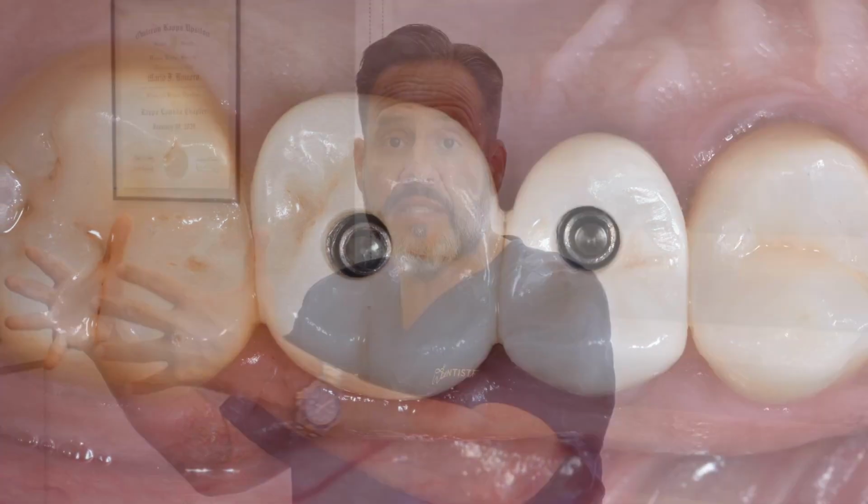That custom abutment is going to give you the support for the tissue that surrounds your implant, giving you the ideal emergence profile and making this tooth look very natural, like it literally comes out of the tissue, just like natural teeth do.